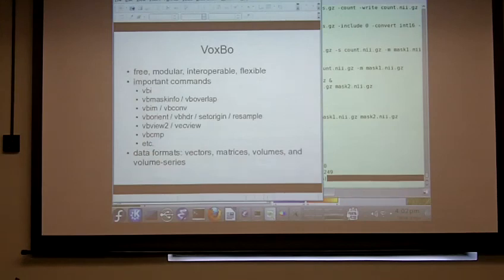I should also mention that one thing that was not obvious, because I didn't have a diversity of files in that directory, is that for the most part, the data you'll see in association with image analysis comes in four flavors: one-dimensional, two-dimensional, three-dimensional, and four-dimensional. 3D files tend to be brain volumes. 4D files tend to be series of brain volumes, like a series of lesions or fMRI time series. 1D files tend to be vectors that have things like behavioral scores or other variables used in your analysis.